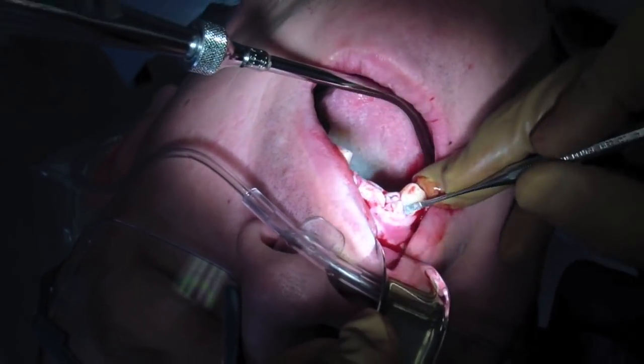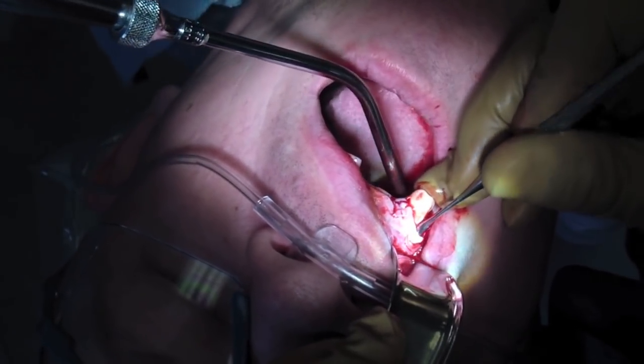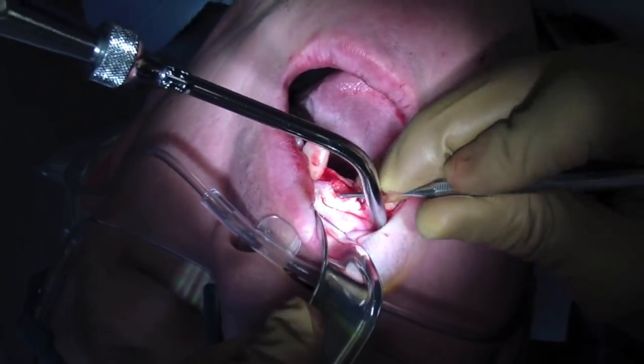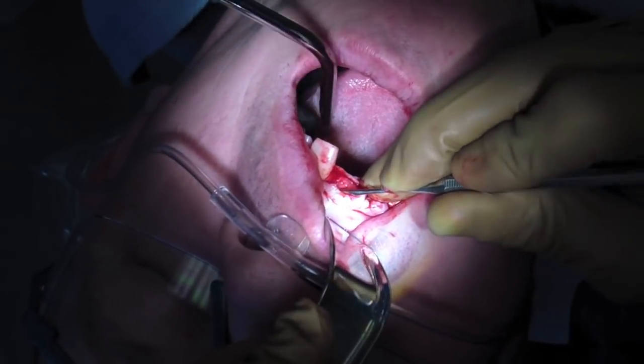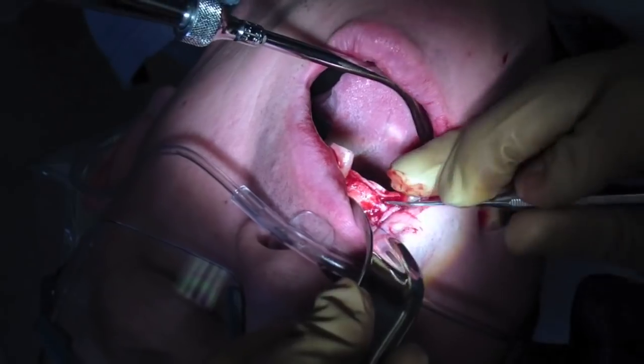So here I'm using a Woodson. Pretty straightforward. The key, if you have no amount of flaps, is your initial incisions. If you're going to bone, go to bone. Don't fool around, hit the bone. If you need to re-change your blade, re-change your blade. Have a few out.